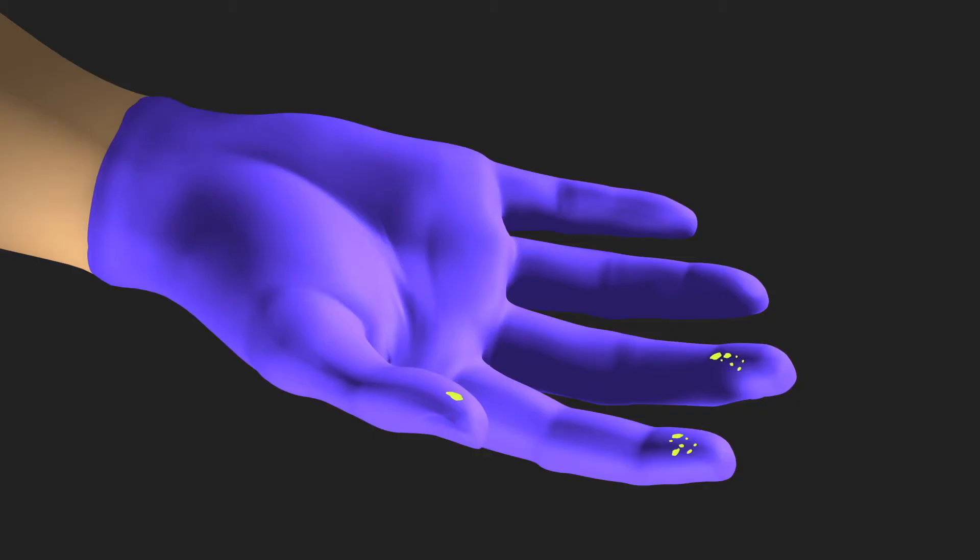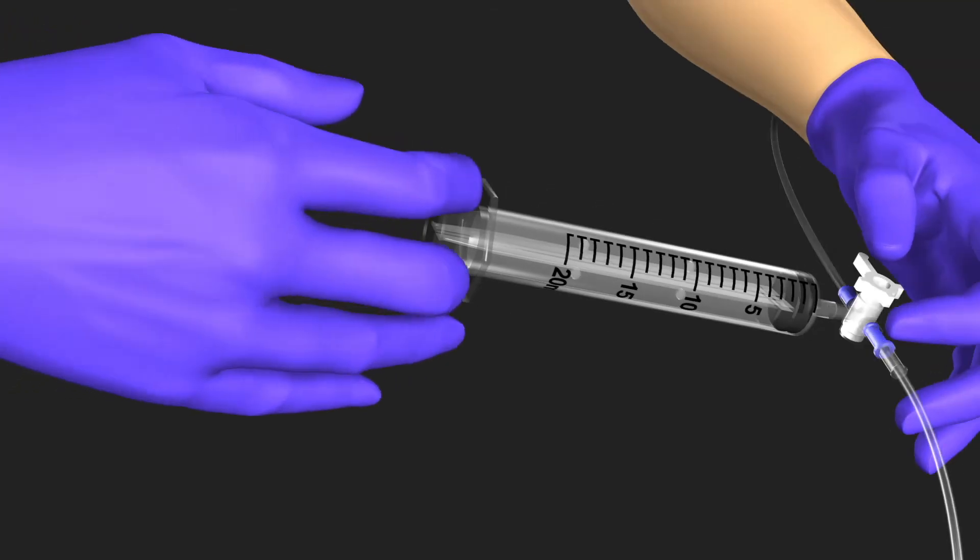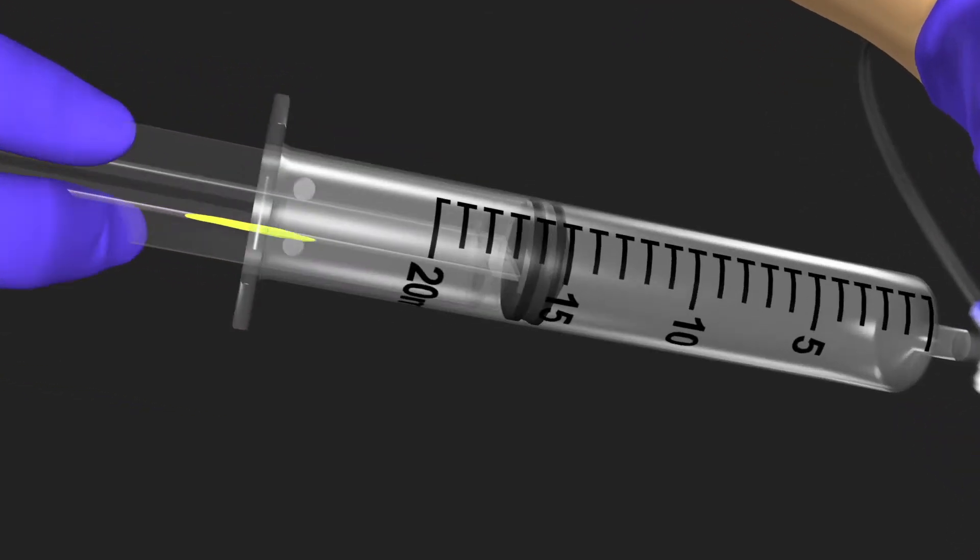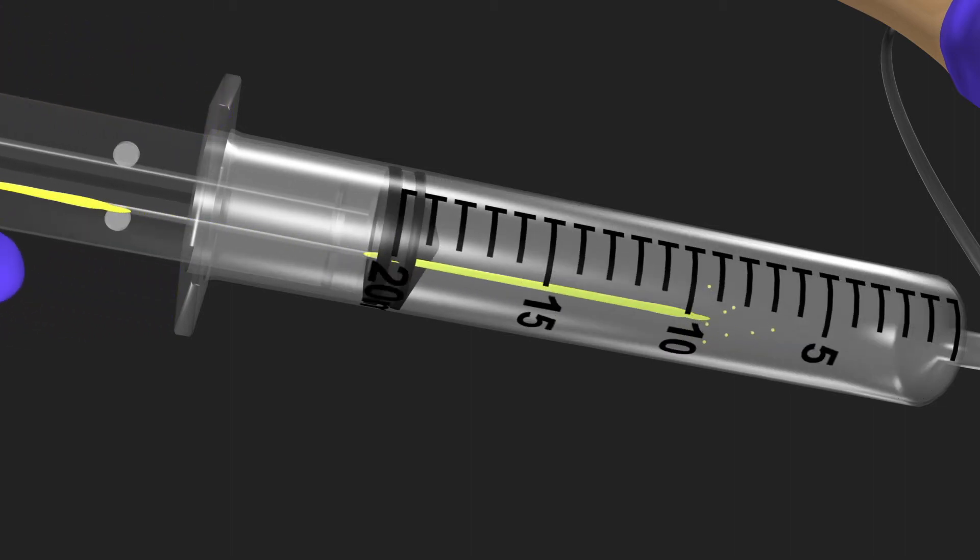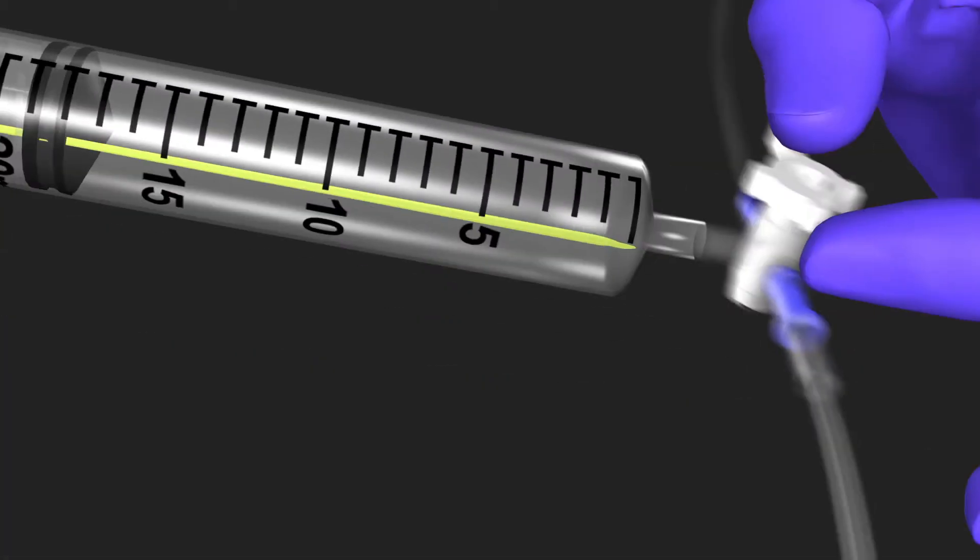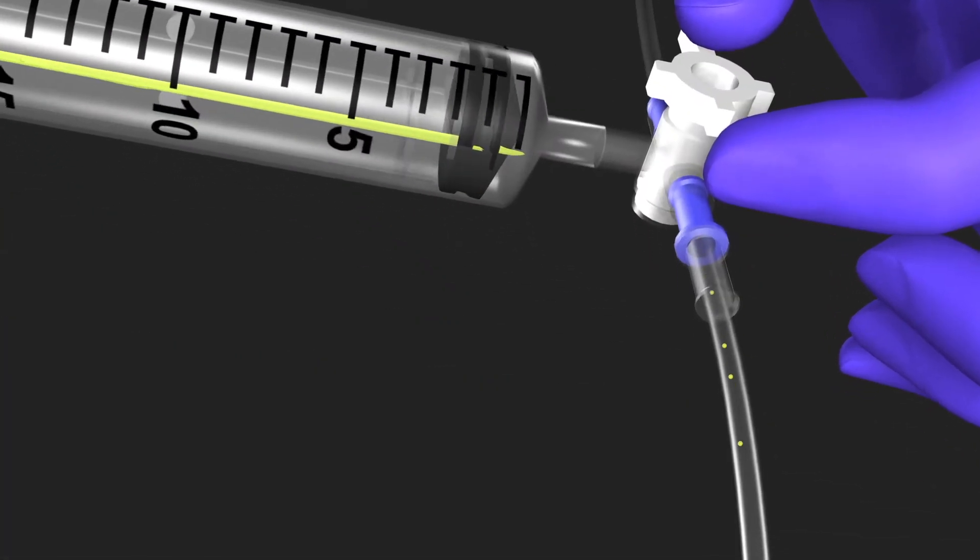Once a gloved hand becomes contaminated, any inadvertent contact with the exposed plunger may introduce bacteria into the syringe. These bacteria then contact the rubber tip of the plunger, which wipes the contamination further into the syringe and subsequently into the fluid being infused.